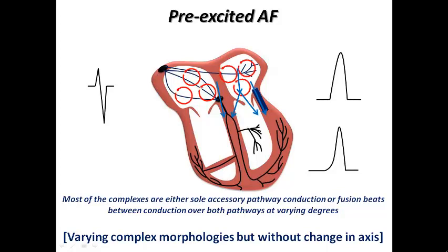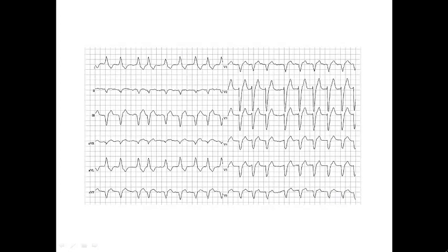So when I see irregular wide complex tachycardia with an extremely rapid rate, some very short RR intervals, and slight variation in complex morphology — I can be sure it is not AF with bundle branch block. Let's look at another example: this patient also has irregular wide complex tachycardia, but here the complex morphology is fixed, and the RR intervals are not very short. This patient has AF with left bundle branch block — left bundle morphology — and it is not pre-excited AF.